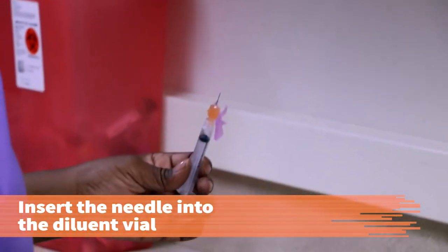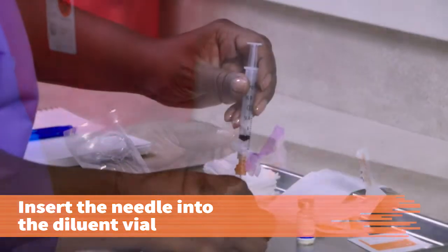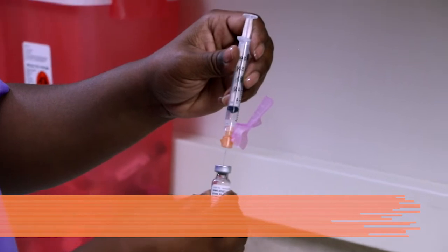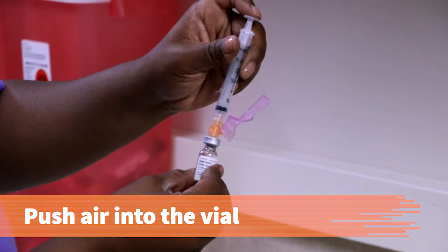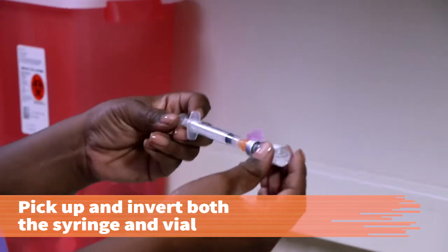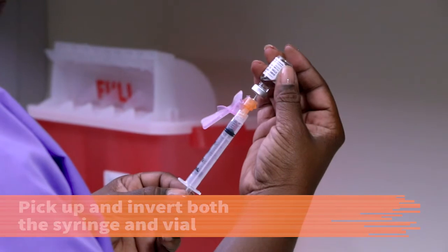Using the syringe with the aspirated air equal to the amount of diluent needed, insert the needle into the center of the rubber stopper of the diluent vial. Make sure the needle is not in the fluid. Push the air into the vial, but do not force the air into the vial. With the palm of your non-dominant hand facing upward, grasp the vial between your middle and index finger. Keeping the syringe unit in the vial, pick up and invert both the syringe unit and vial.